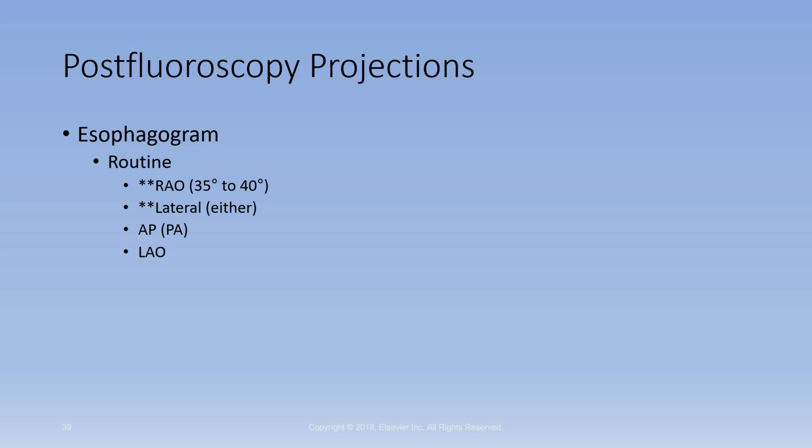Now, this is where it gets a little bit confusing, not like anything else in our field isn't confusing, but with the invention or addition of digital fluoroscopy, because the fluoroscopist has the capability to take the imaging during fluoro, sometimes, and I would say most often, they are not doing the overhead images after the exams.